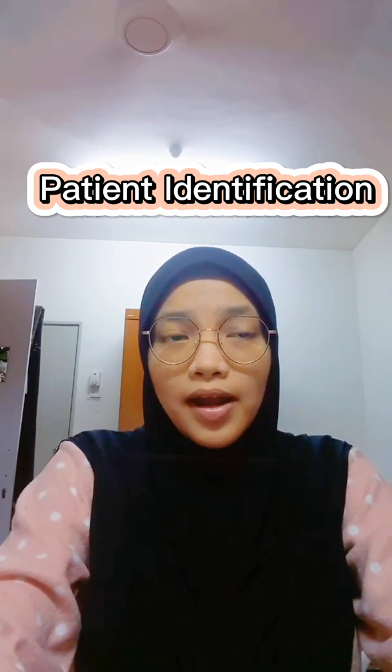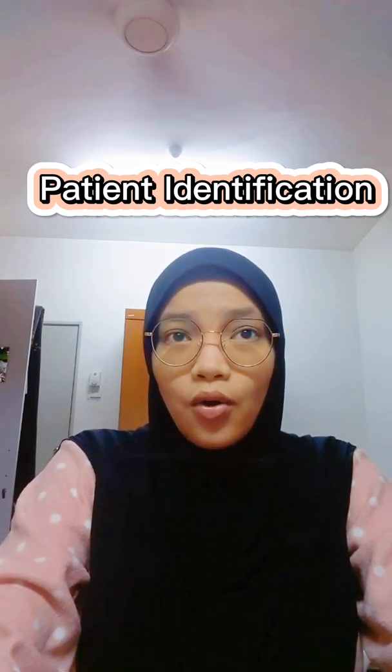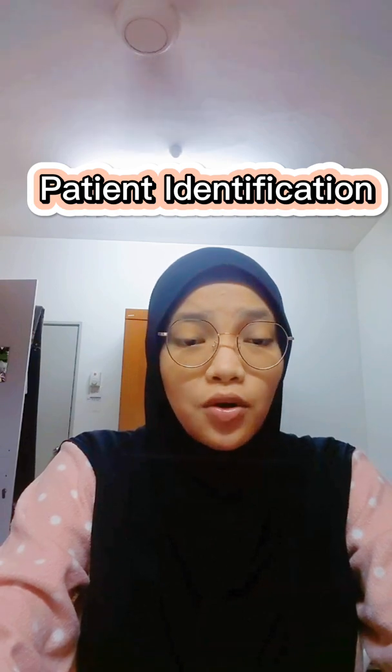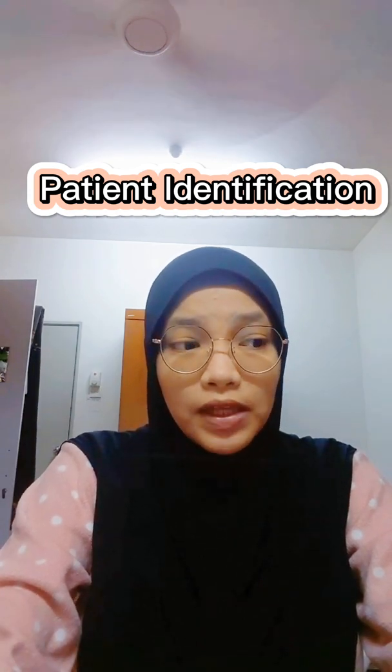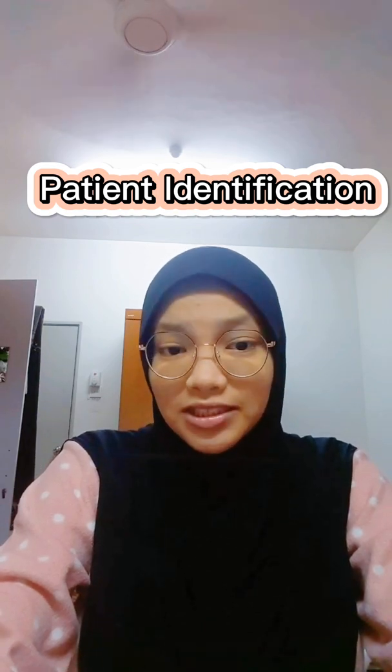So for the correct examination, we have to ask the patient or reconfirm with the patient the site or area of interest. If it is different than stated, then we must consult the referring physician.